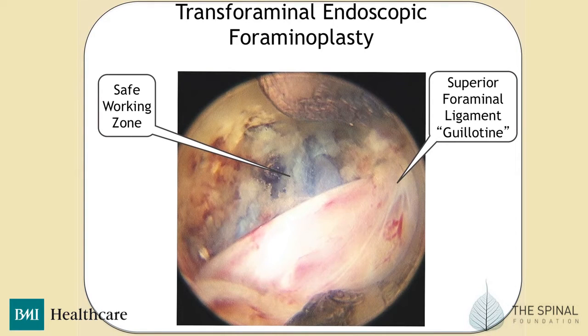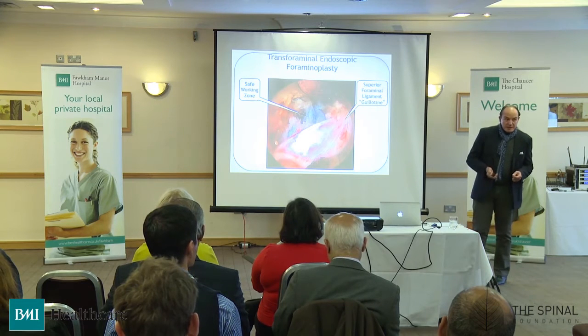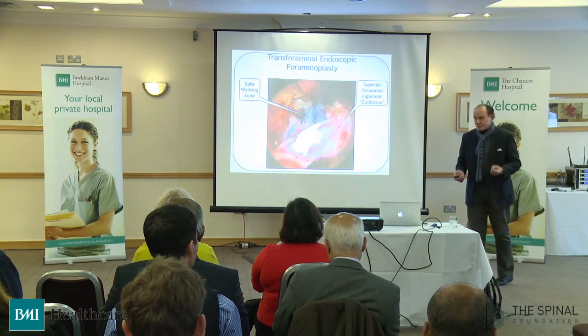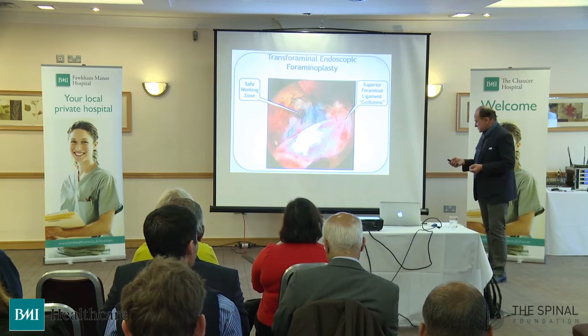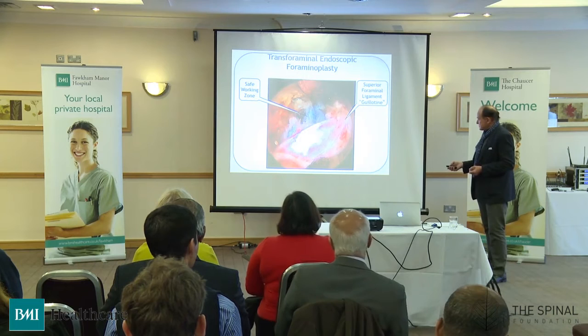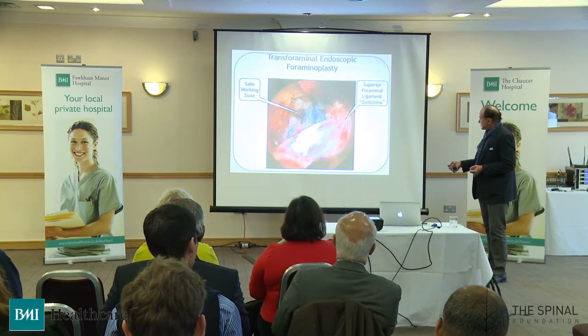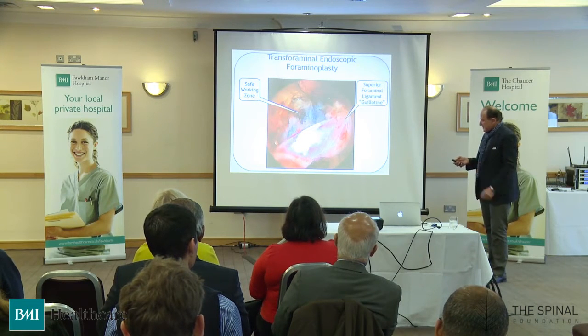And after quite a little time, we've excavated the area, removed the scarring, you begin to see the bone here of the facet joint, and this is the beautiful nerve, still covered to some extent by the superior foraminal ligament, but now the protection of epidural fat is coming through from the epidural space in patients who haven't had previous surgery, that is, to continue to protect the nerve. And this, of course, is the dorsal root ganglion. The nerve is just beginning to swell into that.